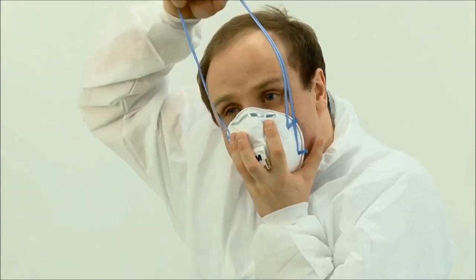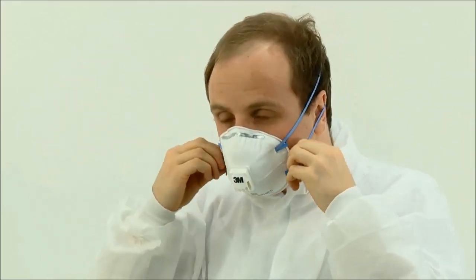Stretchable, braided headbands provide comfort, along with a lightweight design. The 3M N95 respirator is comfortable for long periods of wear.